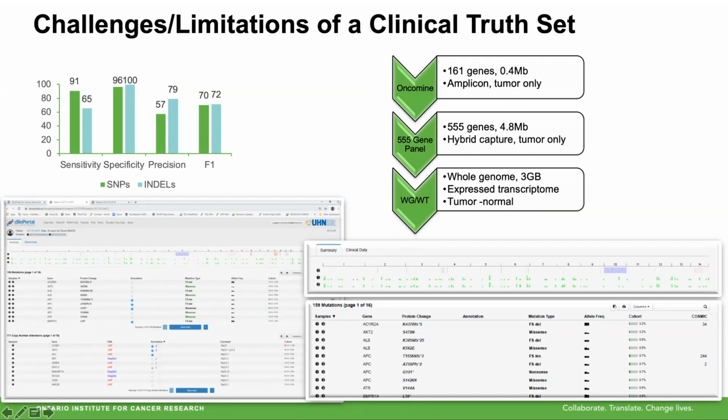We also, because we've incorporated tumor normal sequencing, have a little bit of a distinct advantage over some of the prior annotated data sets in that we can filter a little bit cleaner than some of the prior reported assays. But you can see in the variant plots below in the green little tick marks there, that between the two assays of whole genome and targeted panels, we have nice correlation, and we also see a lot of the mutations common in both the targeted panel and the whole genome. Next slide, please.